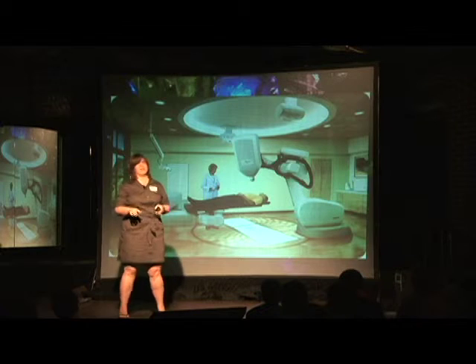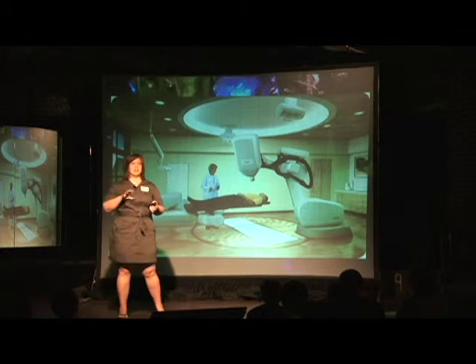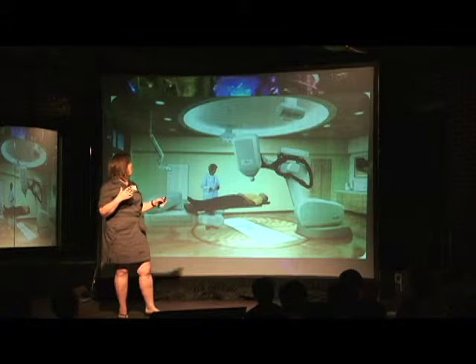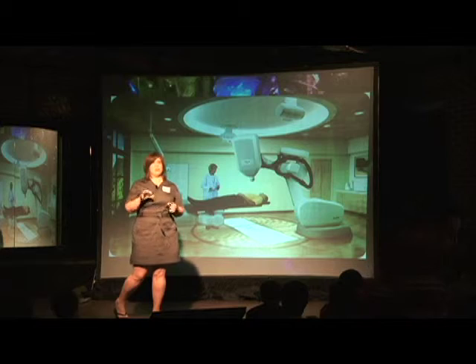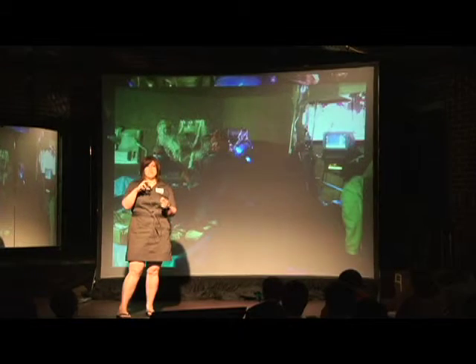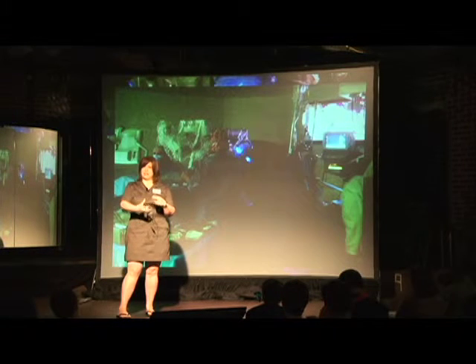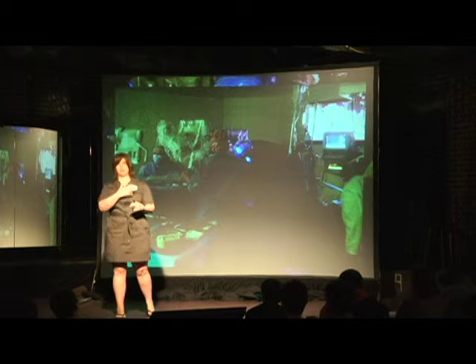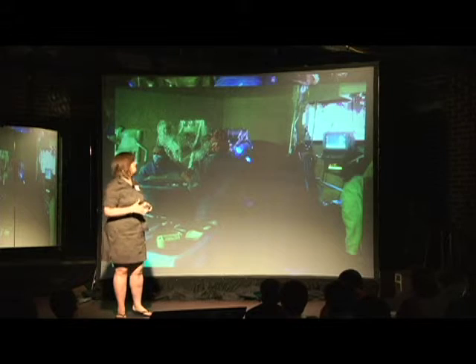Now, this is a CyberKnife. I get asked a lot of questions about CyberKnife. And just to clarify, I don't work with CyberKnife, but just to educate you, it is not surgery, but it is a great delivery system for radiation. It's an old auto robot that they use to actually rotate around the cancer, so that it spreads out the area that you actually have radiation on your skin, reducing that kind of secondary contact stuff you get.